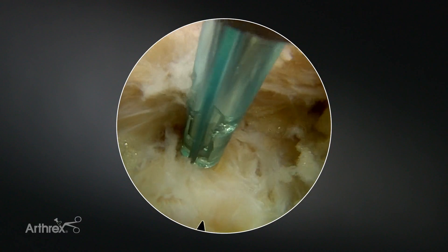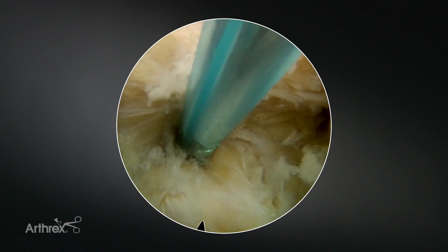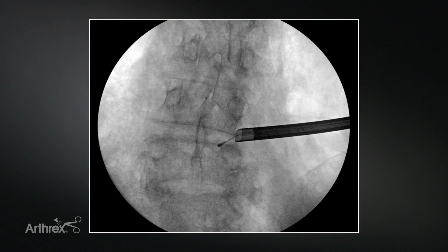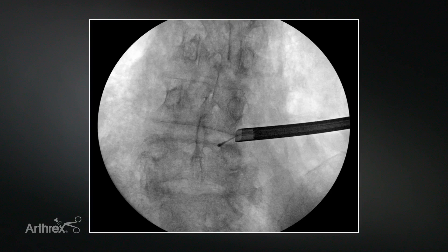The way to identify the floor of the canal is to insert your electrocautery device caudal to the disc. What you see on the x-ray is that the tip of the cautery is exiting the disc space — it went past the end plate, which means you're on the floor of the canal. It's also medial to the medial wall of the pedicle. That's the medial wall of the pedicle that the tip of the cautery is on, and it's outside the disc, which means you're on the floor of the canal. If you were inadvertently inside the disc, as you extend this out, it would deflect off the end plate, and that would tell you that you're not in the spinal canal.